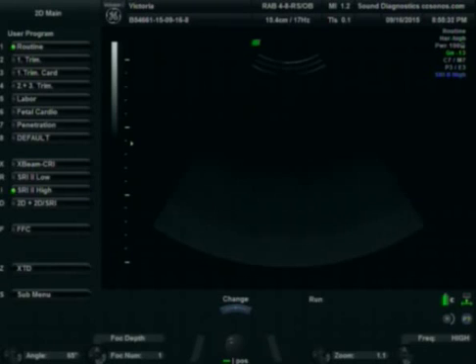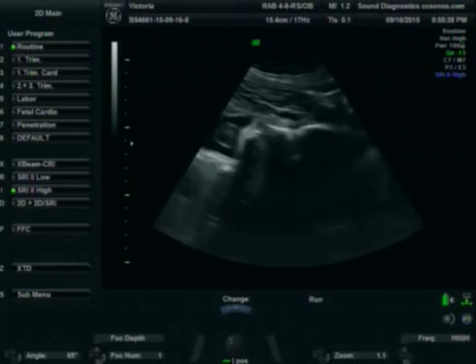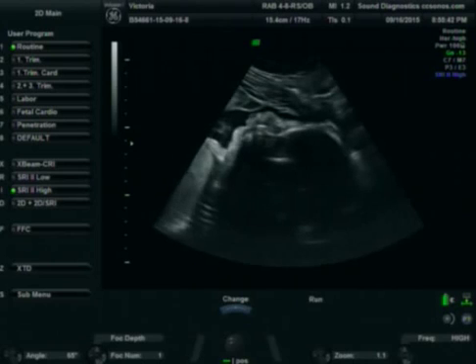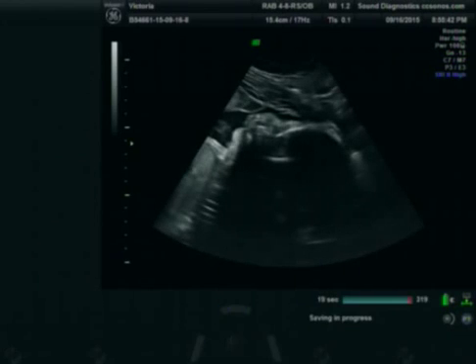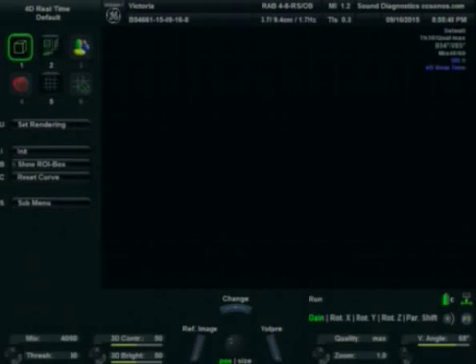All right, go ahead and lie flat on your back. Let's see if we can get this baby to situate in there a little bit. She's situated. Well, we're getting some moving. Smushed. Just not necessarily getting much more fluid around it. Fingers all up in the face.